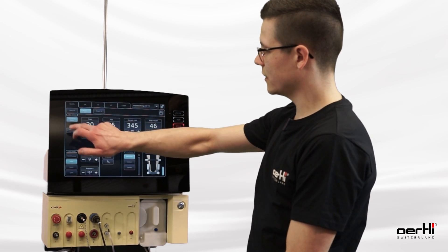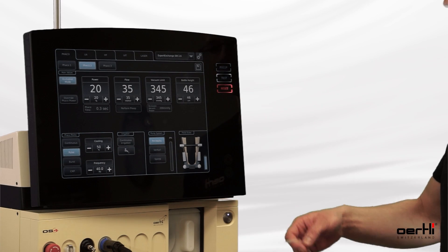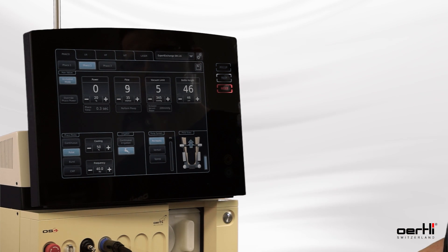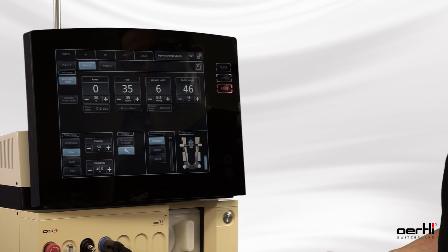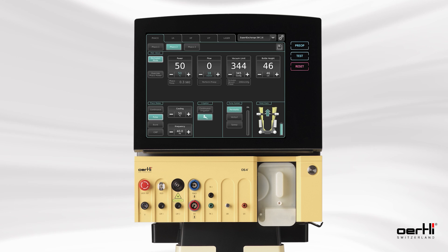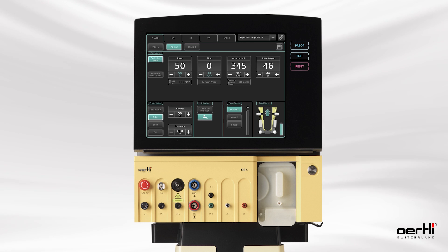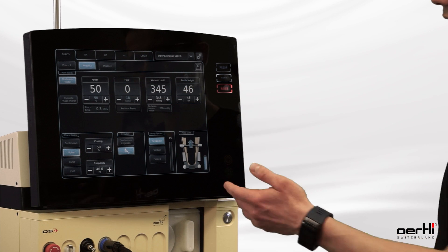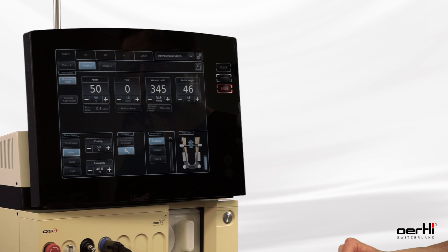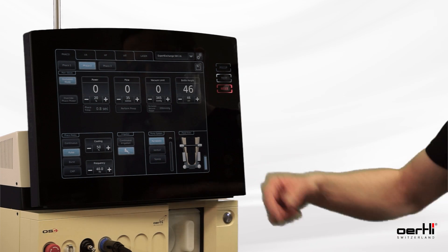Now I activate the occlusion mode and do the same again — I also simulate an occlusion. The vacuum grows, and now what you can see is that as soon as I pass the trigger, the FACO power and the flow turn to green. These are the values I just configured for the occlusion mode, and now I can apply 50 percent of FACO power as soon as there is an occlusion.